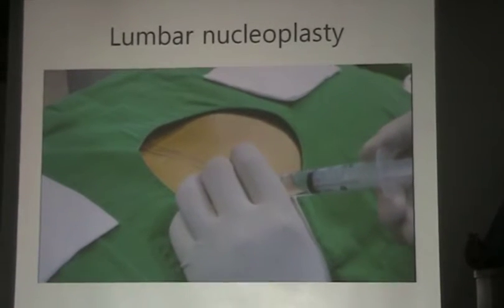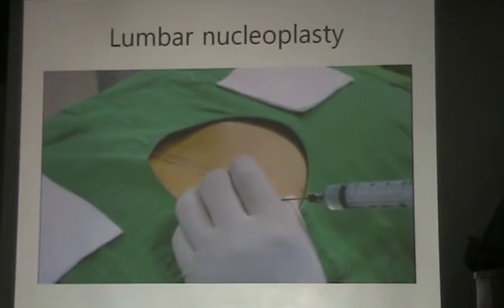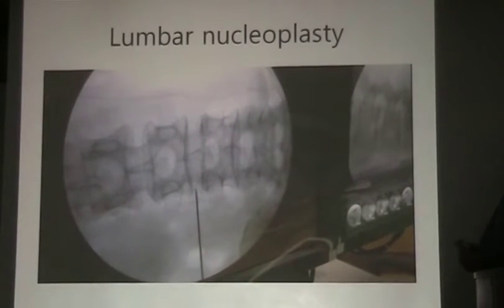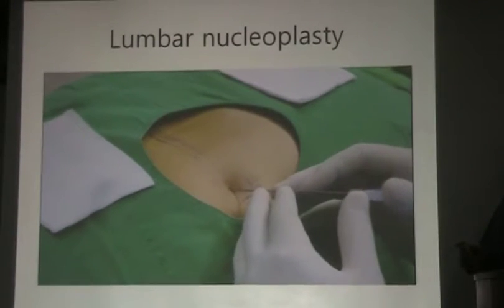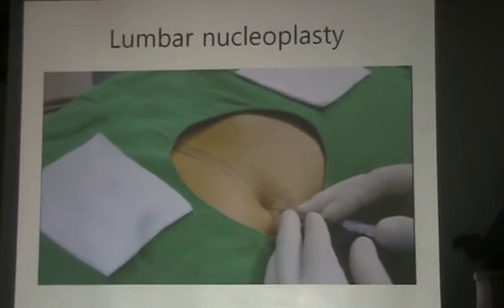Facet touch is very important. And muscle injection. 18 gauge spinal needle injection, touch facet like this. 18 gauge long spinal needle insertion like this, and touch facet.